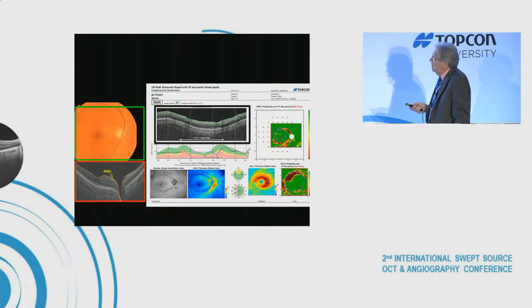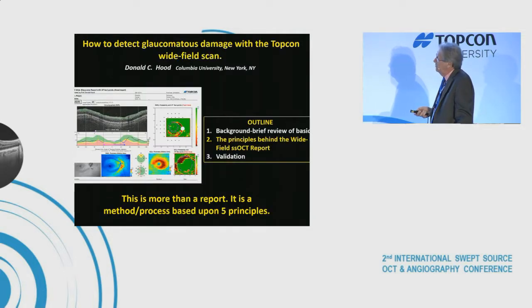All right, so first of all, this here is the circle scan. Well, how did we get a circle scan? Well, it's actually derived. So the software takes the retinal nerve fiber layer thickness, takes a circle region here, actually an annulus, and then averages the OCT information and produces a derived circle scan. So it would be the equivalent of that.